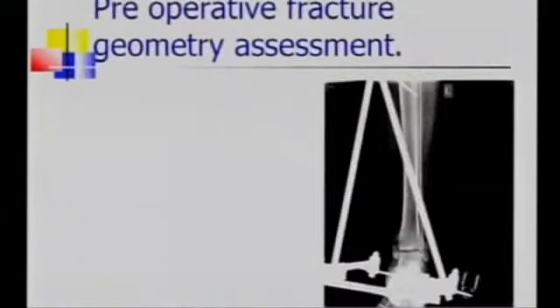Now this particular distance between the tibia and fibular medial border is important, but different literature shows different values. Again, how important they are, we will see. Definitely, if there is no overlap on mortise view, it is going to be a diastasis, a syndesmosis problem there. In this case, these are not my slides. These are borrowed from Roger Mann's book.